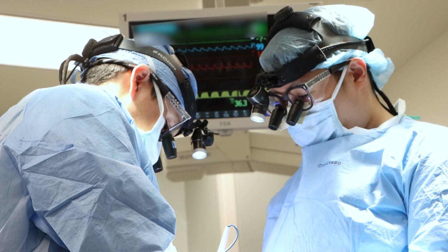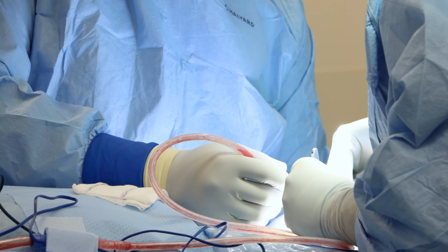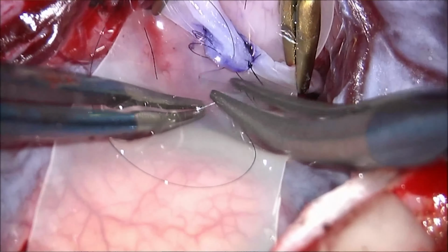The typical bypass operation is comprised of a lot of very small and very critical steps. Our first step is isolating the donor artery without damaging it, and then we have to expose the portions of the brain where we want to target that donor flow so that it most helps the areas that are blocked. Finally, we find the recipient vessel. We do a lot of measuring and testing in order to figure out the best recipient, and then we set up in order to perform the actual bypass anastomosis, where we suture the donor into the recipient.